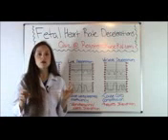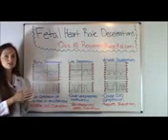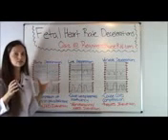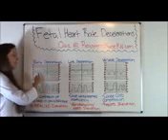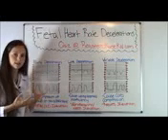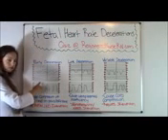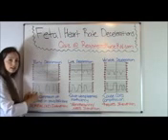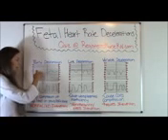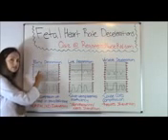So first, let's go over early decelerations. With the early deceleration, whenever you start looking at your tracing, you need to look at mom's contractions and compare them with how the baby's heart rate is responding. Okay, mom's having a contraction. See how it's peaking up through here? And whenever mom has a contraction, baby's heart rate was baseline, and then it's just being affected and going down just a little bit.